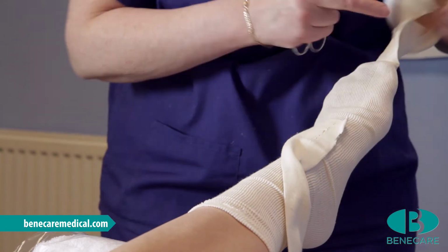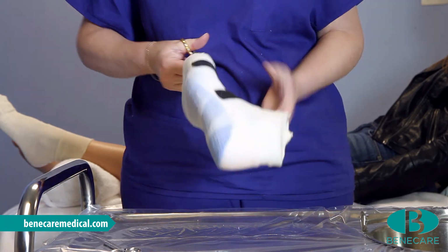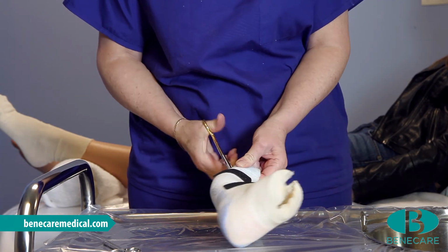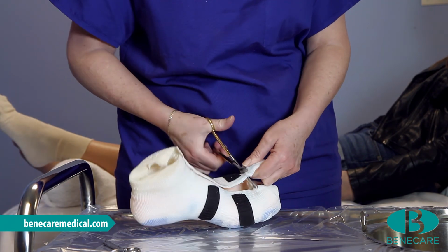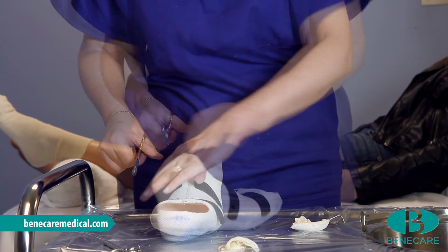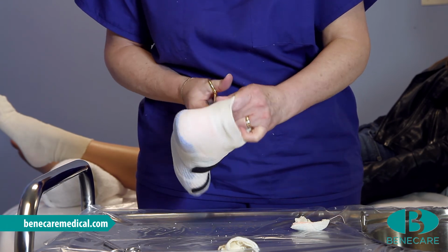Remove the cast from the limb. Cut following the template previously marked, starting at the base of the toes and continue across the apex. Trim around the ankle, ensuring it is below the malleoli and flared higher posteriorly on the Achilles tendon.